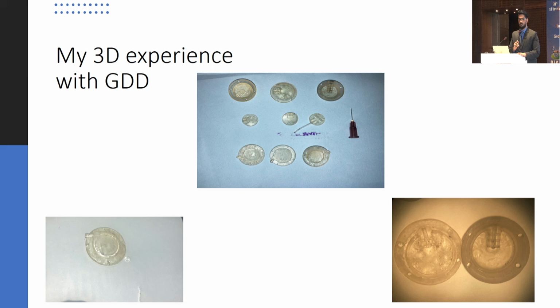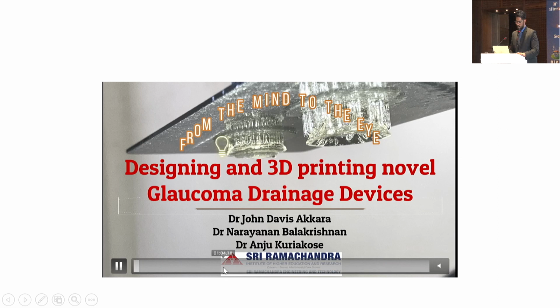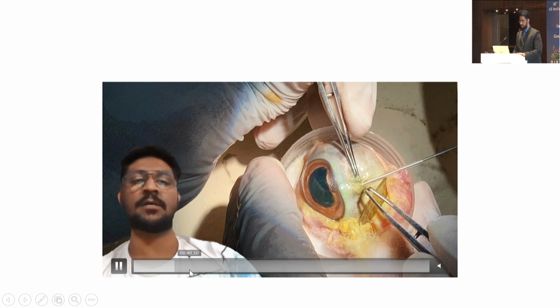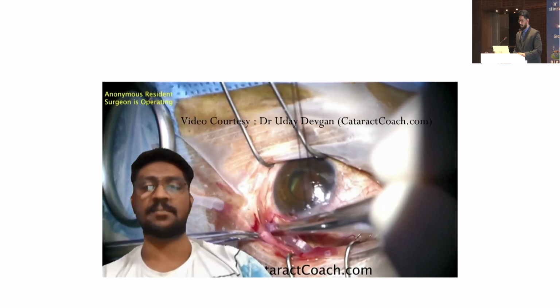The device has a footplate and a polymer-based tubing in the front. To design these 3D-printed devices, we looked at the possibilities. 3D printing these devices could be very expensive and difficult, and the learning curve was also a lot longer. So to get the actual shape, we decided to use the original dimensions of the implant to get a simulated variant as close to the original as possible.